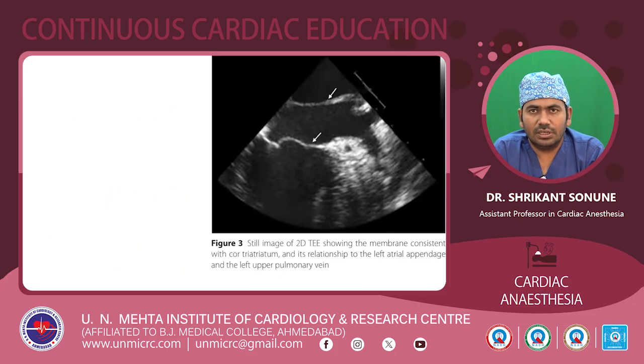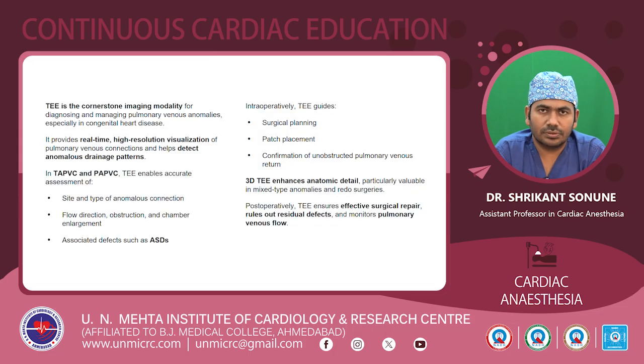In the echo image, the mitral valve leaflets, typically the AML and the PML, are seen, and the thick fibrous band which separates the left atrium from the AV valve is seen. So this is the classic presentation of cor triatriatum, which can mimic mitral stenosis.